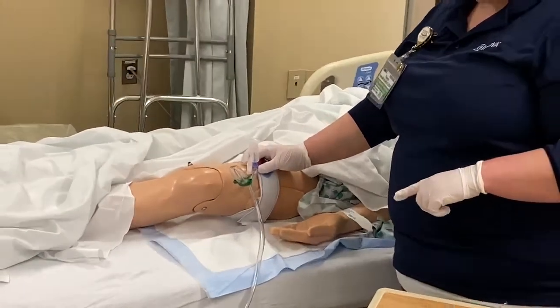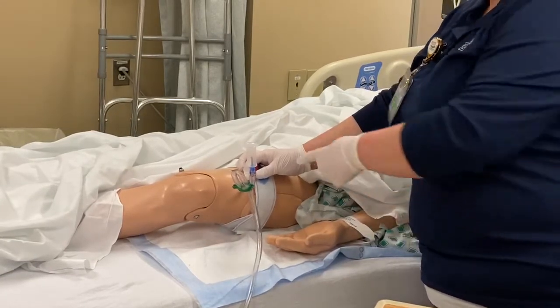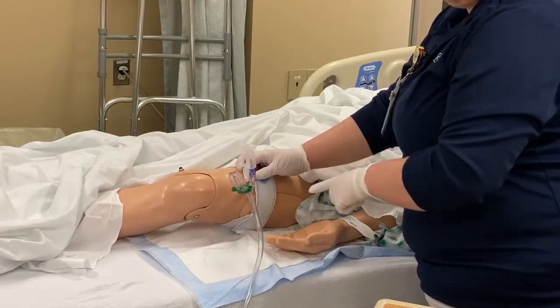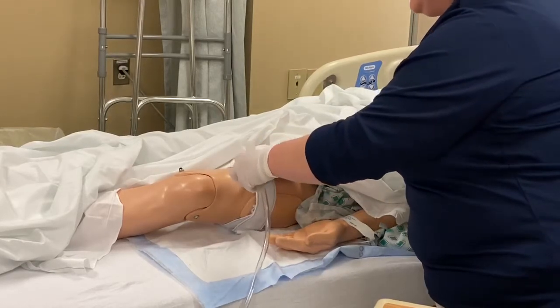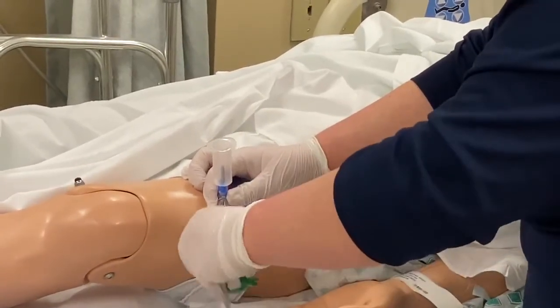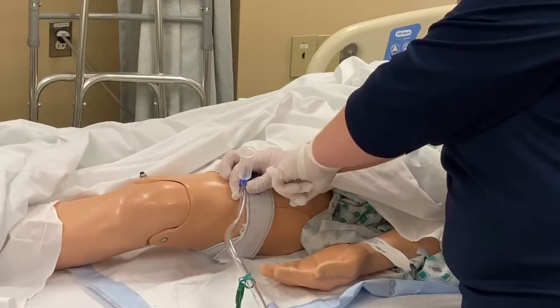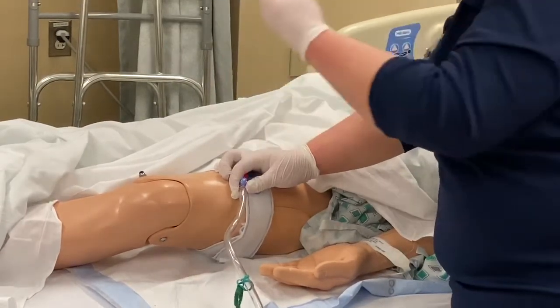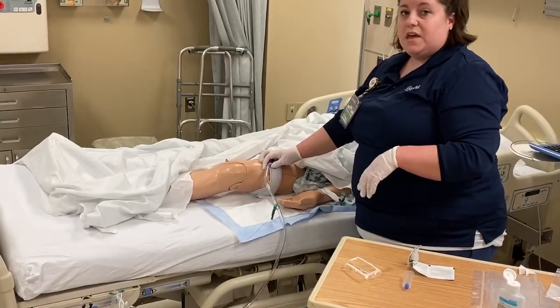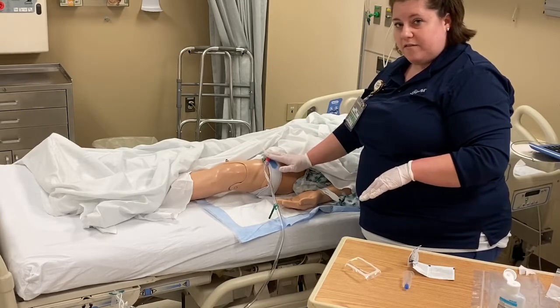And now, the first thing that I want to do is take this clamp off. If you notice though, I'm still holding my port. I want to remember that I have 2 things that I need to remove, but the clamp comes off first because I have that time limit and I want to make sure I don't leave this on because it could cause harm to the patient. I have not removed my hand from here, so now I remember to take off my transfer device. I'm going to set this on my bedside table because my sharps container is across the room and I don't want to leave my patient unsafe, okay?